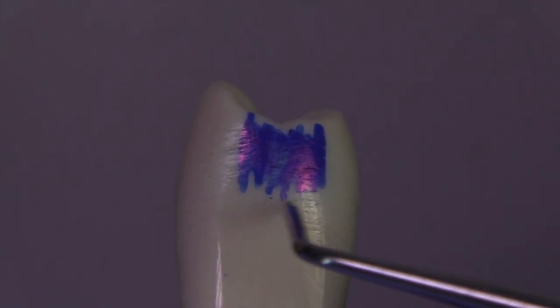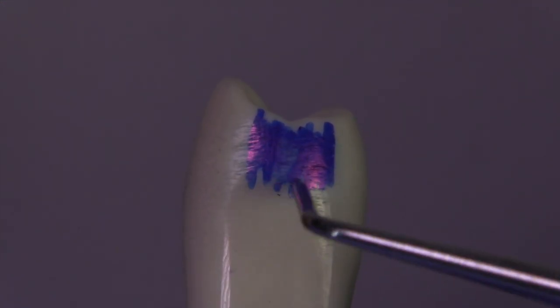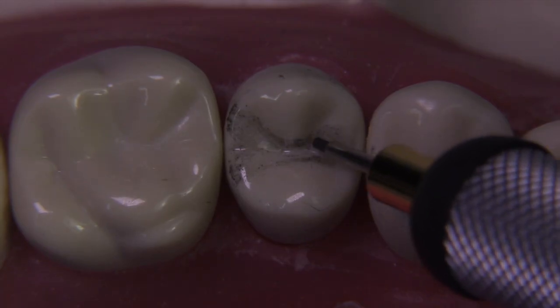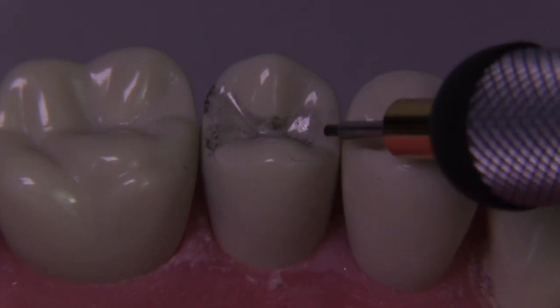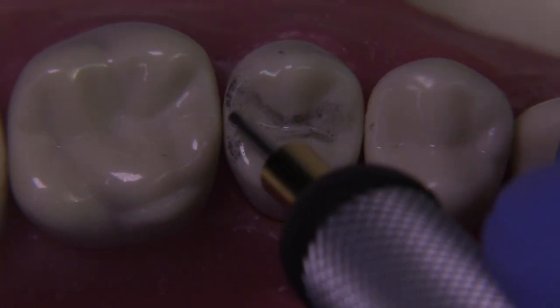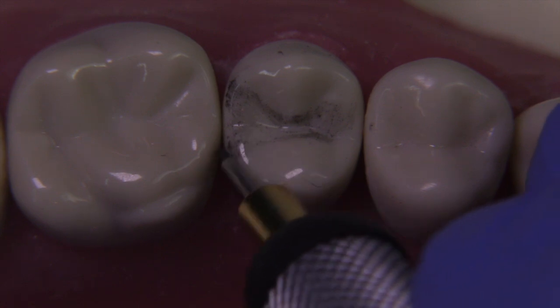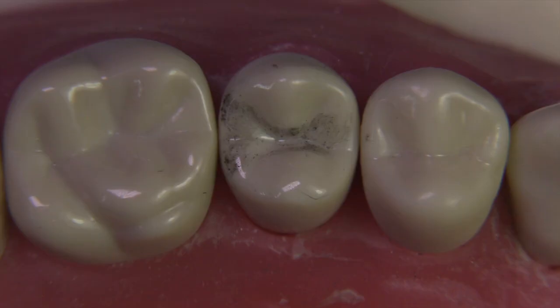You really need to drop your box pretty far gingivally in order to break contact adequately. Sometimes it's a good idea to draw the outline form while you're practicing, to get an idea where your extensions are going to be, how wide your isthmus will be, where you're going to stop your dovetail — in this case midway between the height of the Marshall Ridge and the mesial pit. Look how wide the box will be relative to the isthmus.